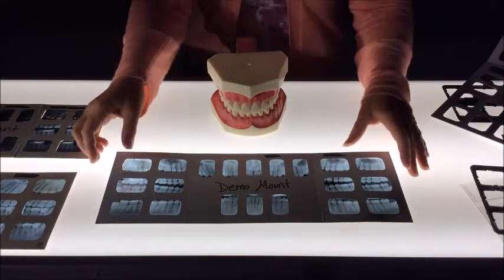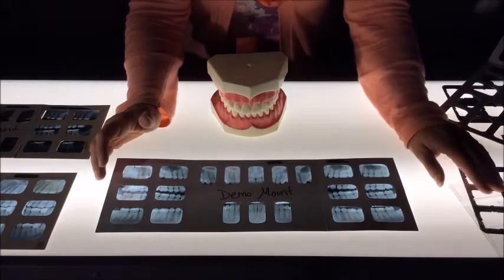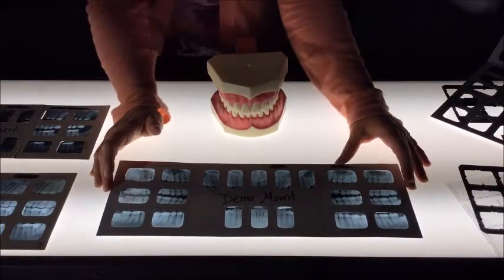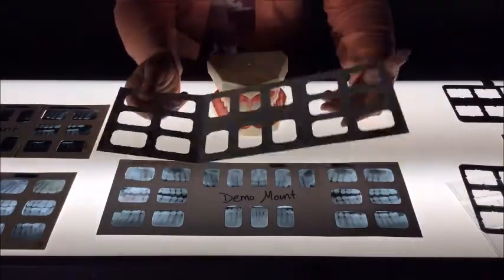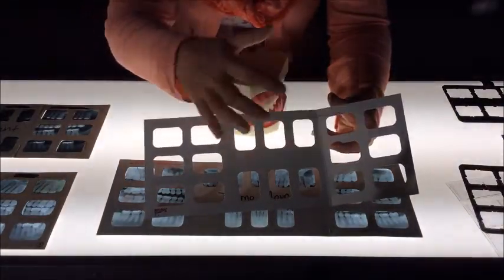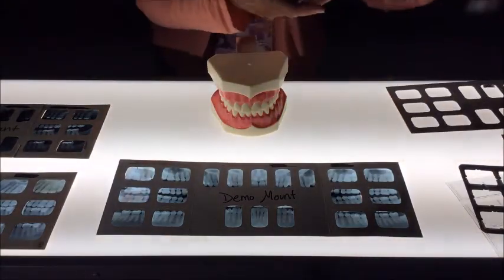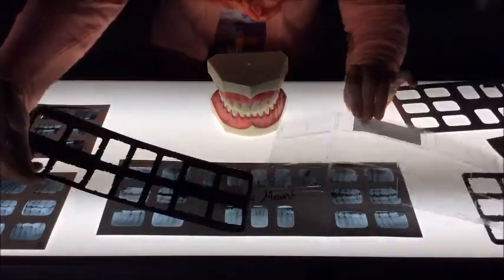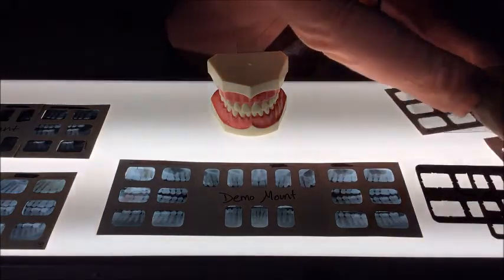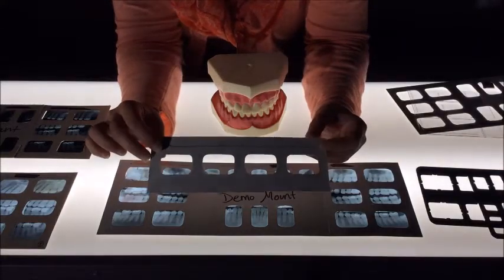And as you can see by this example right here, and examples that you have laid out during your lab, there's different sizes and shapes of film mounts. Film mounts can come in conventional cardboard with name, date, provider, the number of films, might be the name of the practice on here. They might come in a celluloid or maybe a plastic film holder mount. It just depends on the provider's preference. The important aspect is whether it's a single film, 4 films, or up to 20 films, that the films are properly labeled.